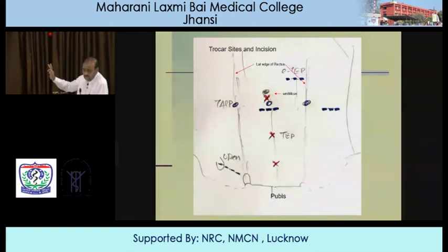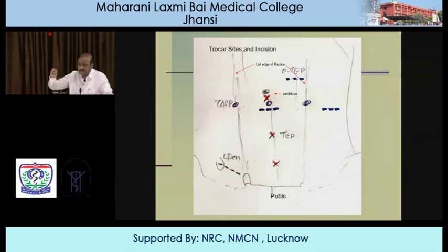You all know that when you do a laparoscopic repair, for those uninitiated, you basically are creating holes in which you put a steel tube, and through this tube you put an instrument, so that it becomes easy to maneuver an instrument. That is basically laparoscopic repair. Right? In one, you put the telescope, in the other, you have a working instrument.